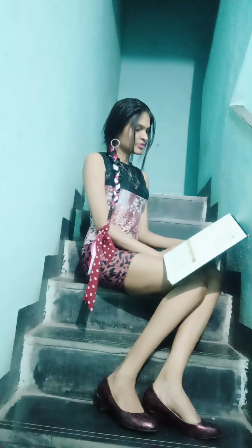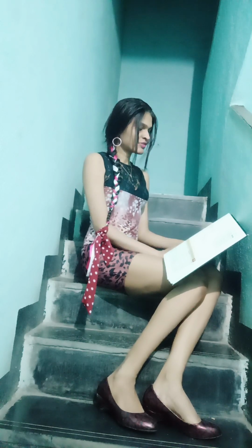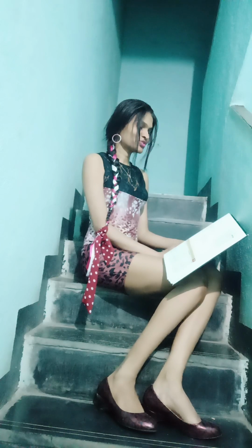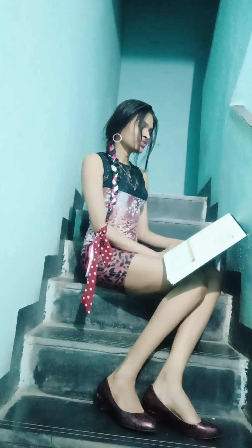The Goldmann 3-mirror lens contains 2 mirrors for examination of the fundus and 1 for examination of the angle. Because of their 7.38 mm posterior radius of curvature, both Goldmann lenses require the use of viscous material to fill the space between the cornea and the lens.